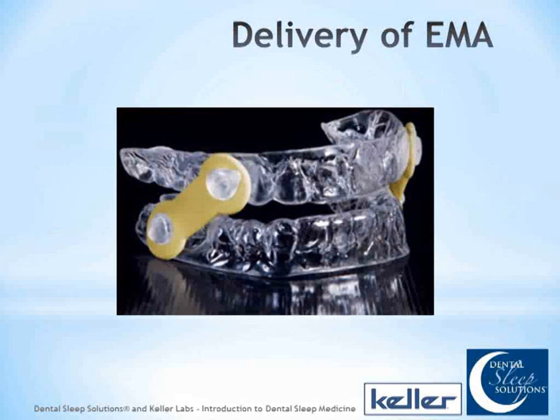I'll talk about the EMA and the delivery of it for a moment. Most of the time, the EMA is made in a harder acrylic, which Keller does a great job of making sure they fit. Just make sure you take accurate impressions like we talked about in the previous webinars. Polyvinyl of some sort is usually recommended. Get them back. Again, you can try these in two separate pieces.